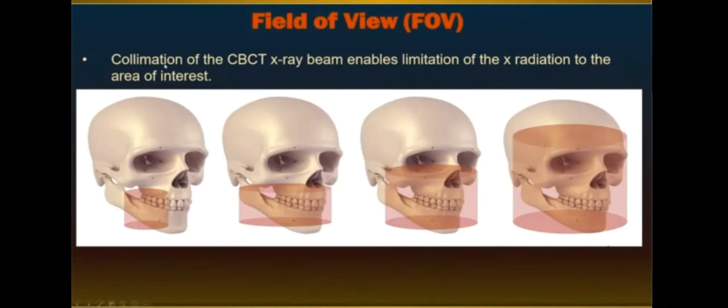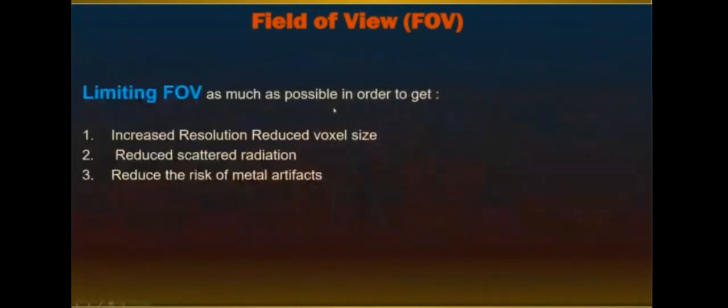The X-ray beam can be collimated just to cover the area to be examined. When considering the field of view, it's very important that we use a limited FOV as much as possible. Why? Because if you expose areas which are not required for implants, like areas containing dentures and restorations, it will add artifacts.